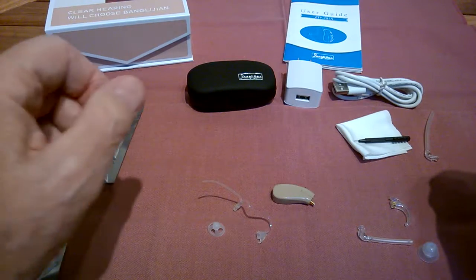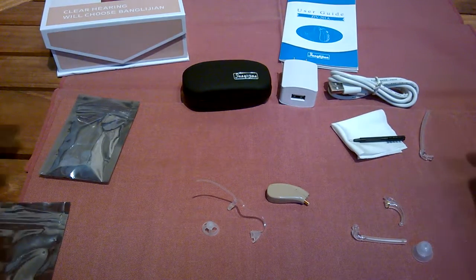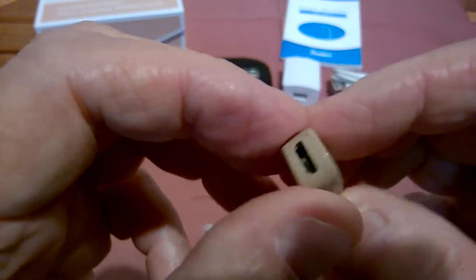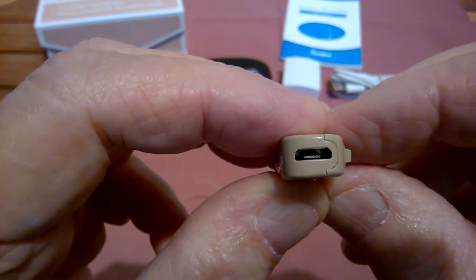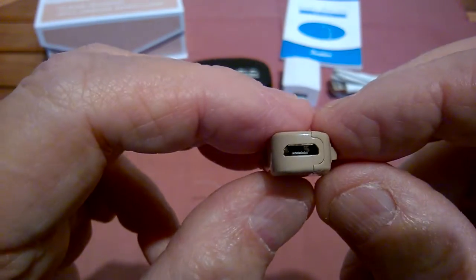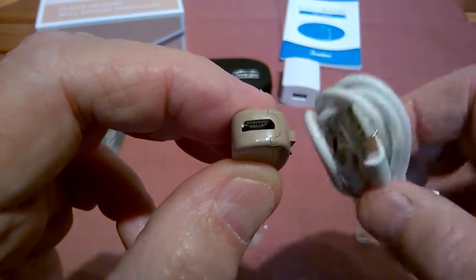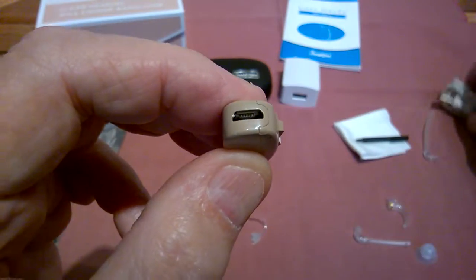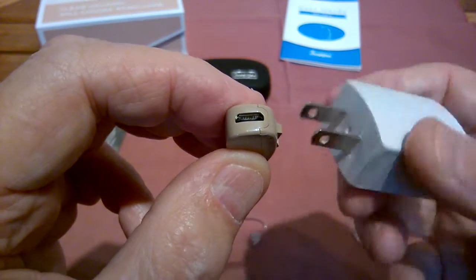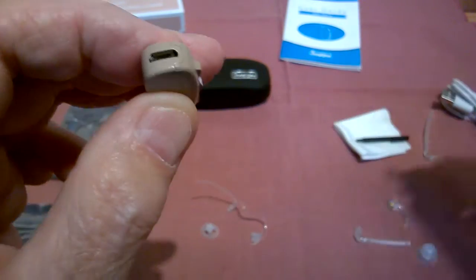I've also got the review up for the 206, which is fine. All of their models, of which they have 8, are all similar in size, and they're all rechargeable. And they're rechargeable with basically a micro USB port like you would have on your phones, unless you have one of the newer phones. But most of the ones that have been around for a while have this. And if you do have one like this, you're all set. These come with a cord, again, the micro USB, and also a wall charger if you need one, if you don't have a phone. Again, USB. Just stick them in any socket. There's no plus or minus side, just any way you want to put them in.